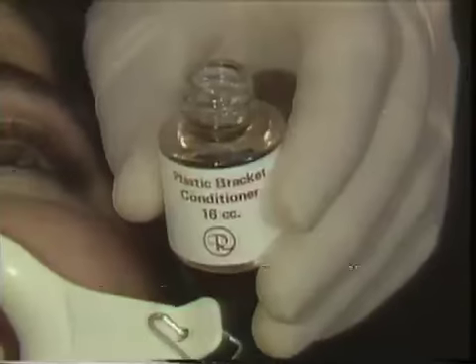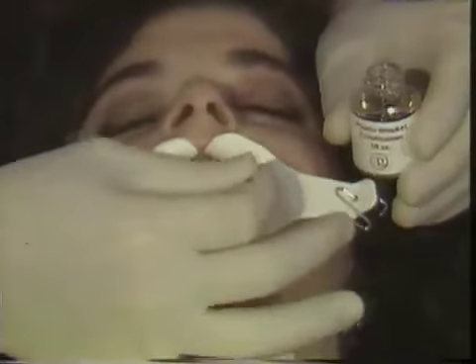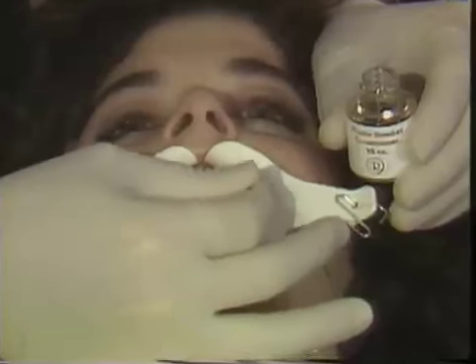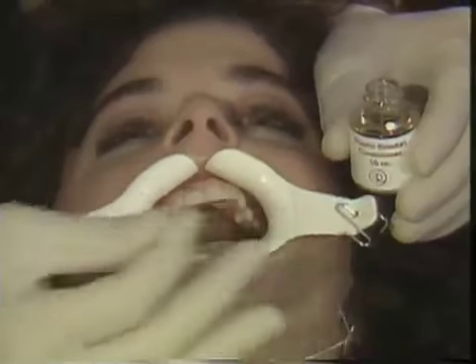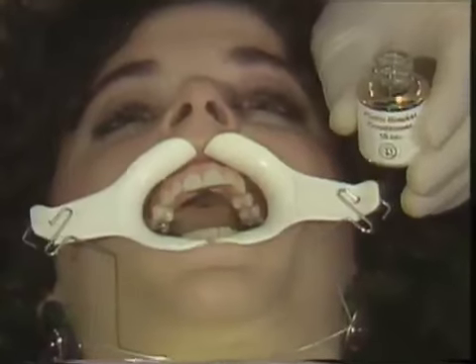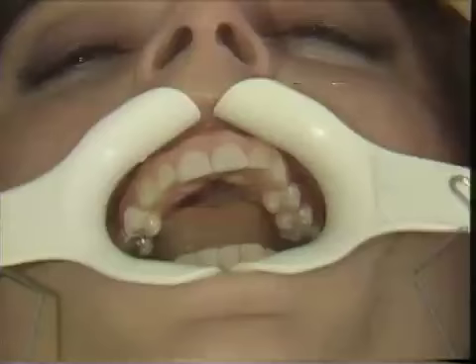After the teeth have been dried, it's important, if you have any teeth that have a composite restoration, to apply a small amount of plastic bracket primer. And this is done usually starting from the gingival surface and working toward the incisal surface. In Amy's case, she has a lateral incisor that does have a composite restoration, and so therefore this type of conditioner must be used.